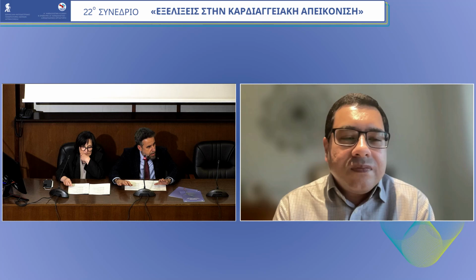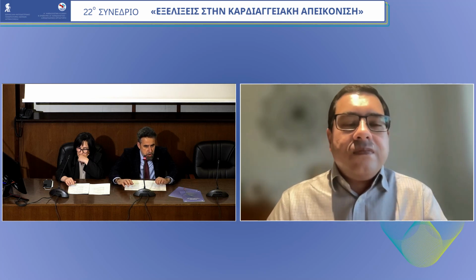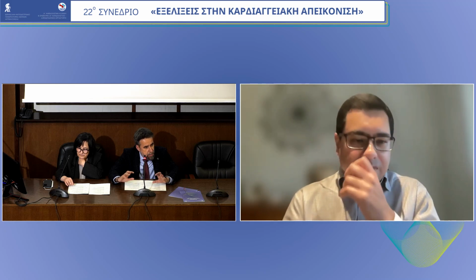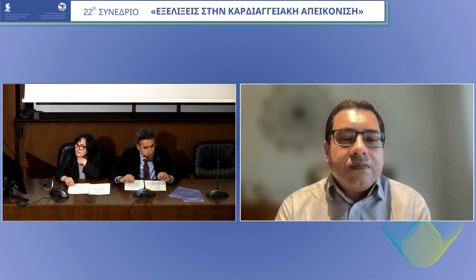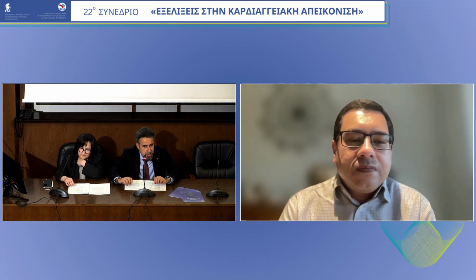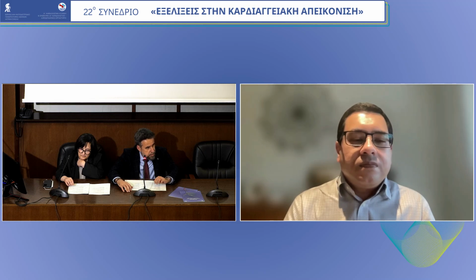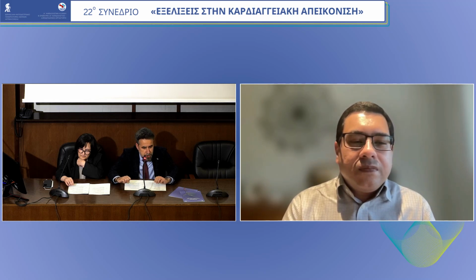Using only echo, and according to your experience, this is the main problem, more frequently to differentiate between pannus and thrombus. So what are the tips and tricks to differentiating this, apart from the leaflet thickness that you have already presented to us? And a second short question again, is AR a marker for these prosthetic valve dysfunctions or thrombosis?